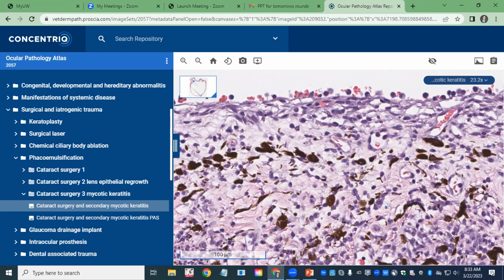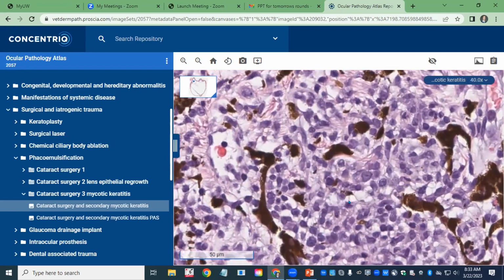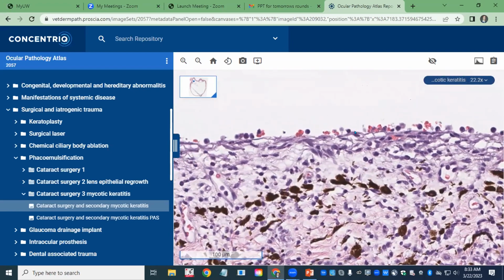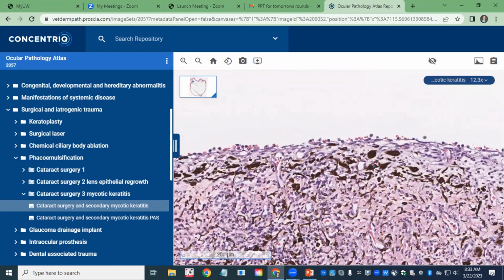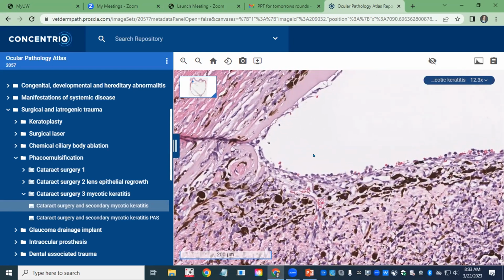So you can see some of those inflammatory cells in the iris stroma. So we have a mix of lymphocytes and plasma cells, and there are probably some macrophages here and there. And some inflammatory cells like to mingle with the PIFM on occasion, or multifocally, I should say. And there's a few red blood cells in the anterior chamber. As Ryan says, most of the globes we get have some sort of hemorrhage in them.